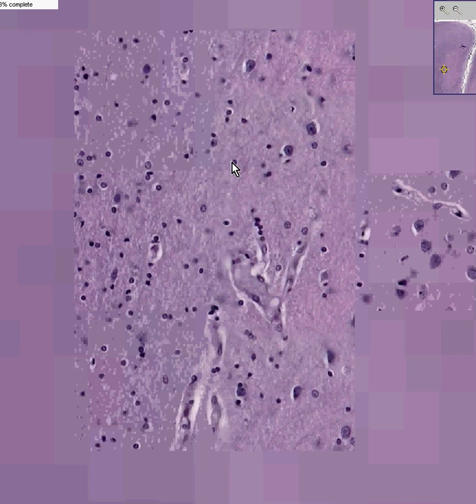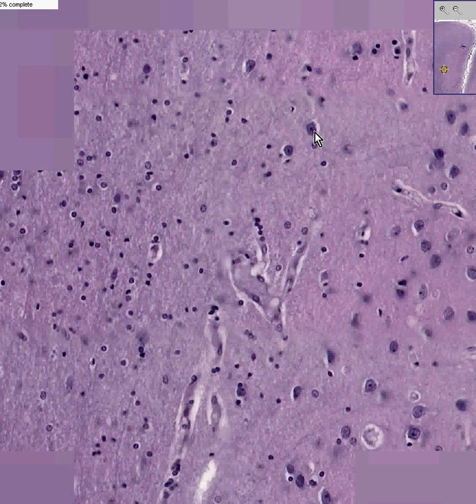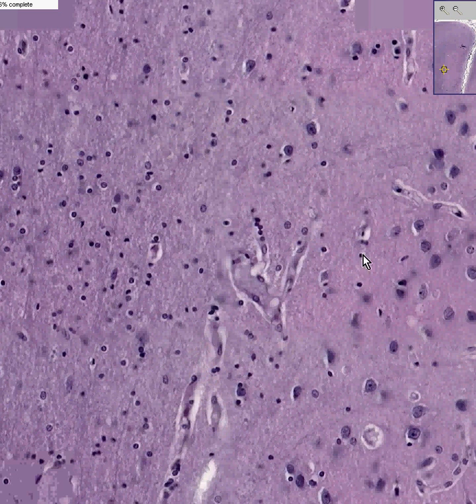See how all of these cells here look small? This may be a neuron up here and up here, and there may be a few in here as well, but all the cells here on the left are glial cells. There's 5 kinds of glial cells. The glial cells, which are chiefly in white matter and myelinate the substance of the brain, are called oligodendrocytes.